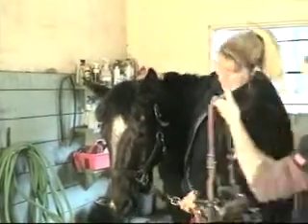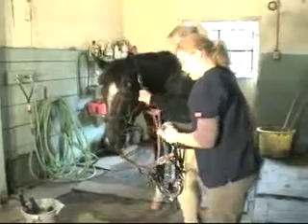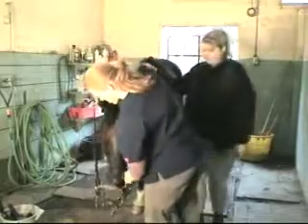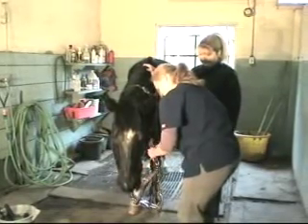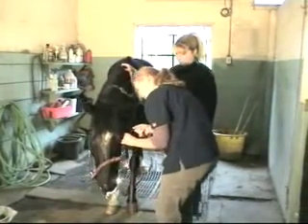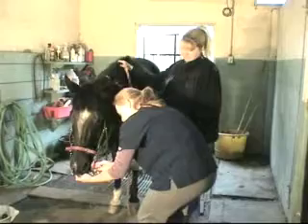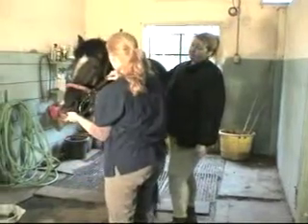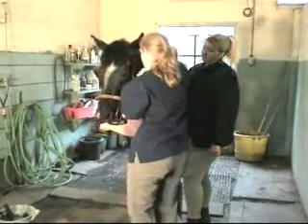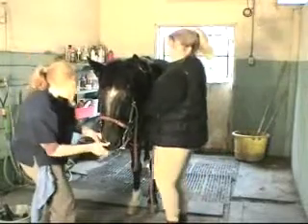Alright, so this is the speculum. It's a full mouth speculum. And what I'm going to do is take this collar off and just put it around his neck, in case we need to grab onto him. Okay, so his mouth fits in these 2 plates. And then once we get everything adjusted just right, we can open up his mouth and get a good look in there. And that way we can get our fingers in there without risk of getting them bit off.